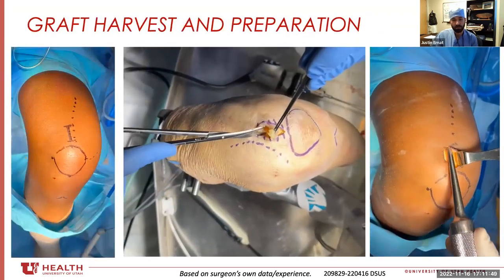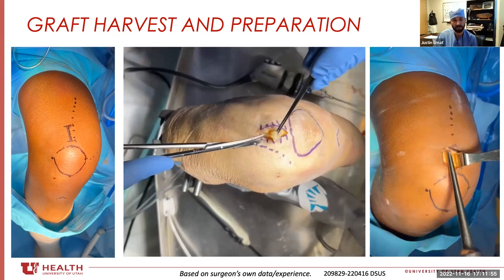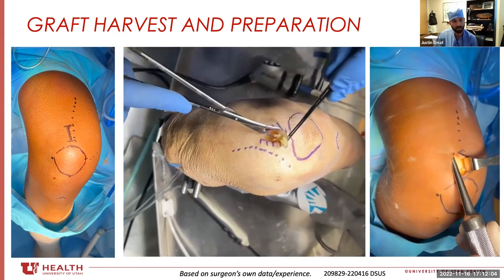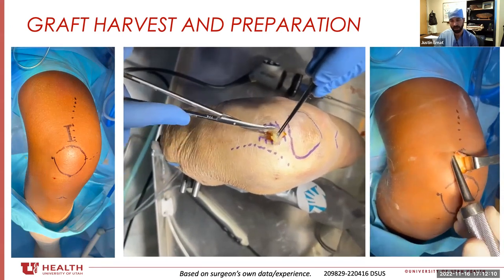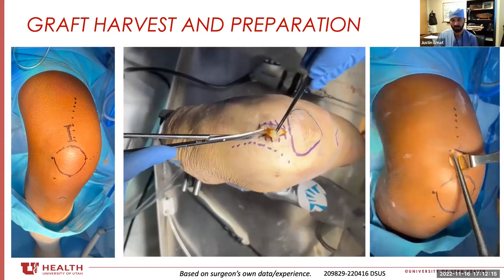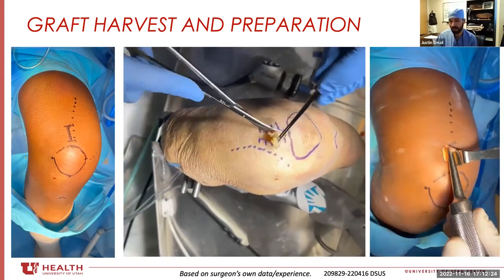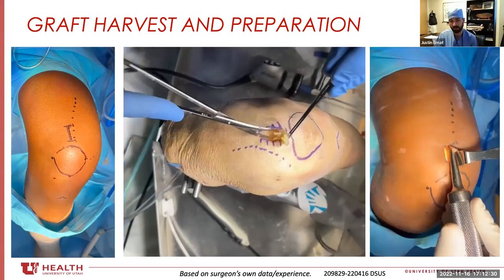There are some videos here, and we'll talk through. This is specifically the harvest — a combination of an actual patient and a cadaver specimen. You can see that the incision really is not that big; it's right off the border of the vastus medialis muscle belly at the superior pole of the patella. I open the skin, excise a little fat, then elevate the rest of that fat off the quad tendon in all directions to get a retractor underneath for good visualization. This elevation is critical because it allows for better visualization but also improves cosmesis by enabling a smaller incision.